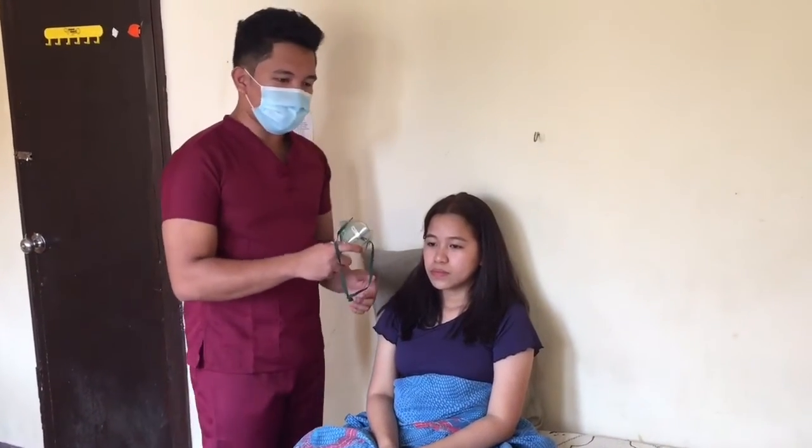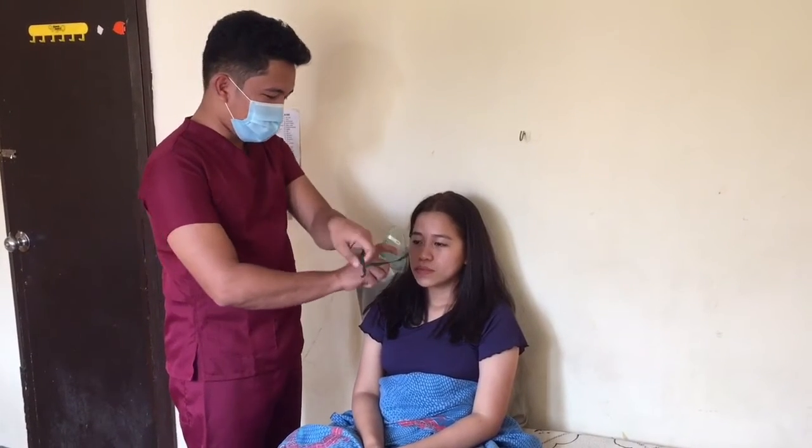Guide the mask towards the client's face and apply it from the nose downward, and fit the mask to the contours of the client's face.